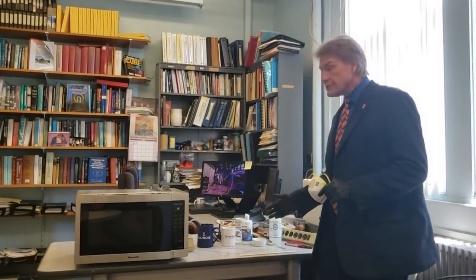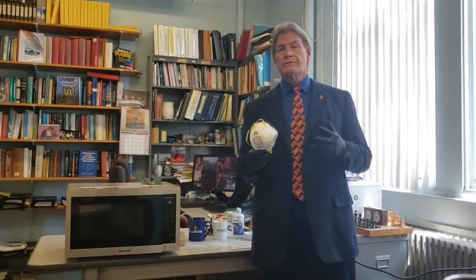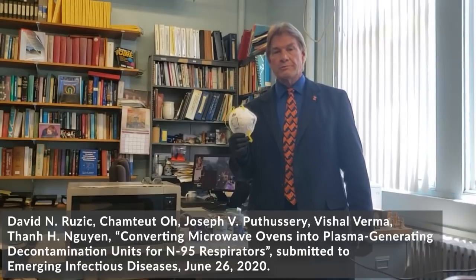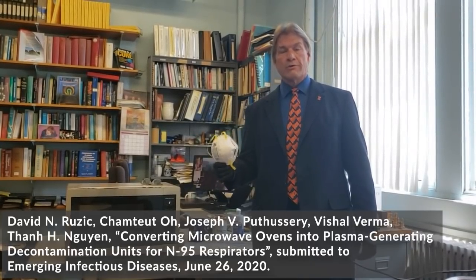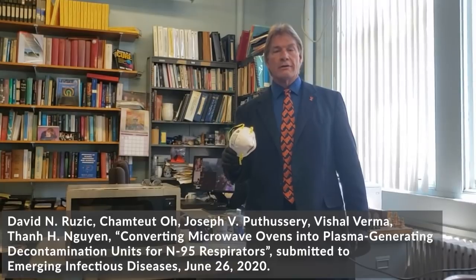That night I went home and saw if I could make a plasma with the microwave oven and common household supplies, so that this isn't something you have to buy — it's just something you have to do. After getting a plasma, the real key was: does it really kill the viruses? So I found Professor Helen Wynn here at the University of Illinois. She, her students, and I have worked very hard the last few months doing viral tests, filtration tests, and fit tests, showing that after this decontamination procedure, the viral load is down to the required levels, the biological indicators are passed, and the filtration and fit are not destroyed.